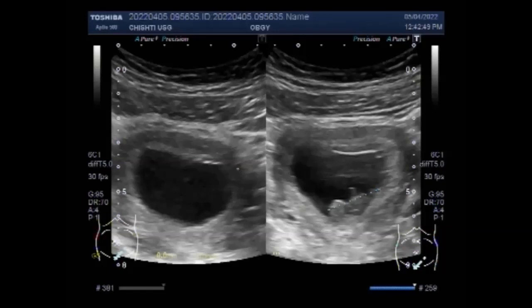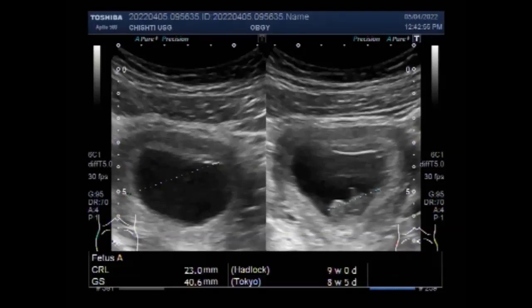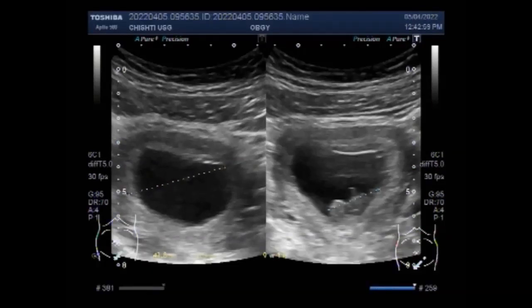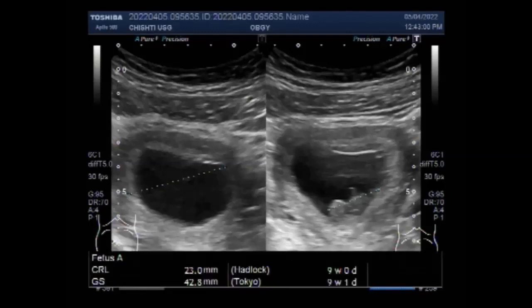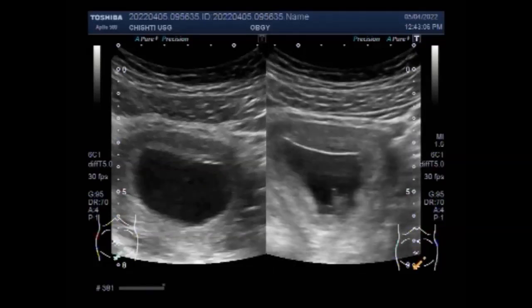This ultrasound video shows a case of missed abortion with pregnancy of about 9 weeks. You can see the gestational sac and a fetus is seen. The gestational sac contains a small fetus, and the pregnancy measures about 9 weeks.